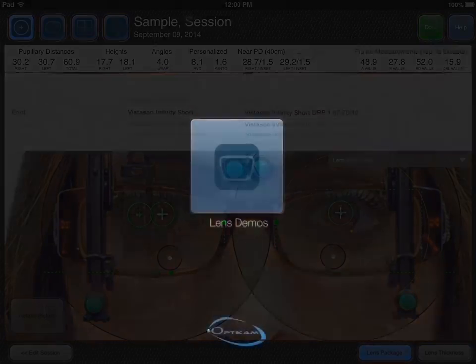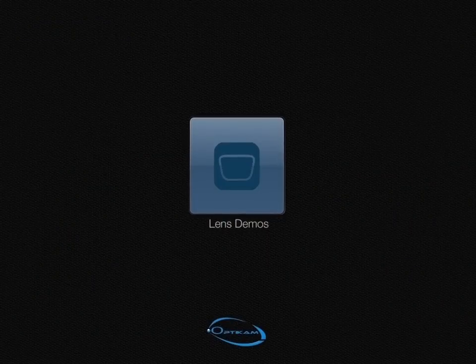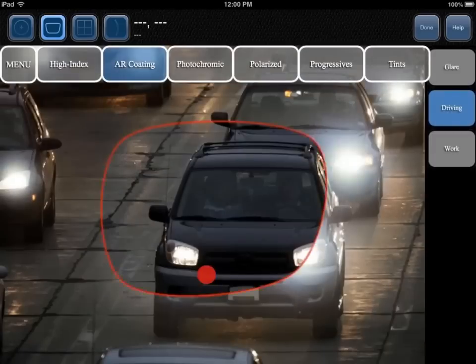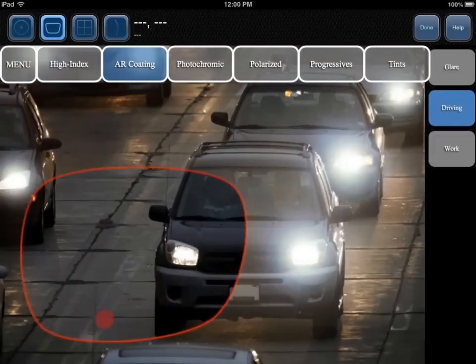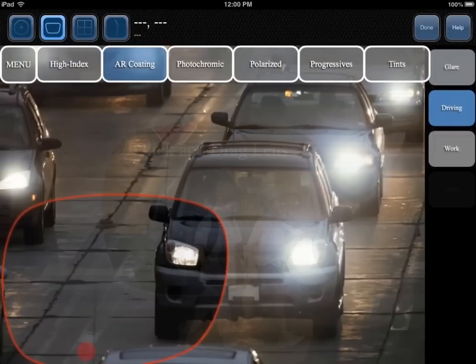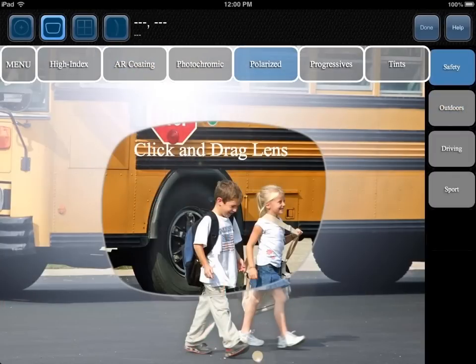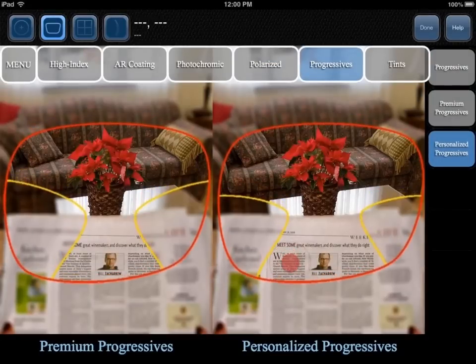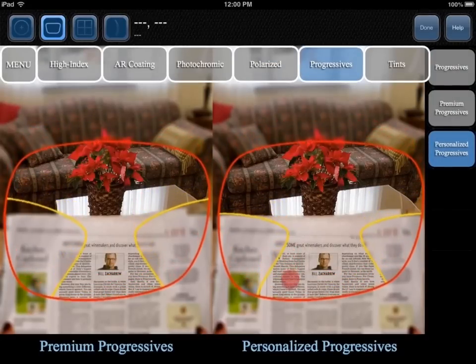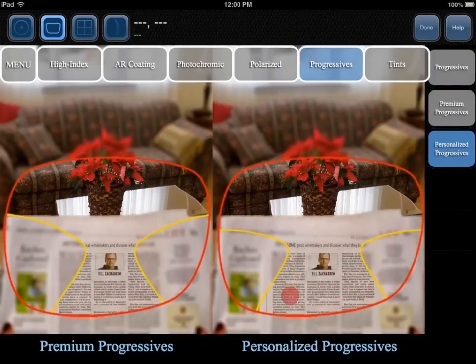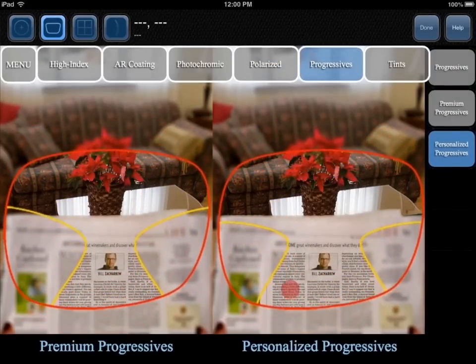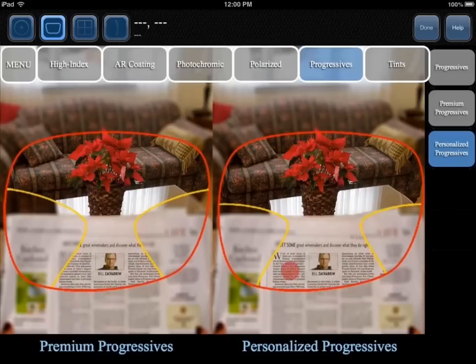The Lens Demos module allows you to demonstrate the advantages of premium lens options in a quick and interactive way. The demos can be navigated by touching the lens options at the top and sub-options on the right-hand side.